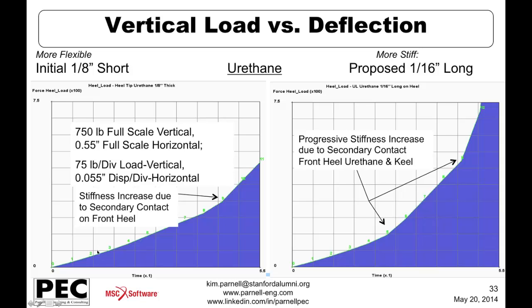And you see pretty clearly the overall stiffness of this short, thick urethane component is lower because there's more bending associated with it. In the initial going, they're fairly similar, but it doesn't stiffen very much as you continue through the additional loading. The other urethane pad, the thinner and longer one, goes through some pretty clear progressive stiffness increases as the contact moves closer to the bend, and there's less overall bending then. Takes more load to provide a given amount of displacement.